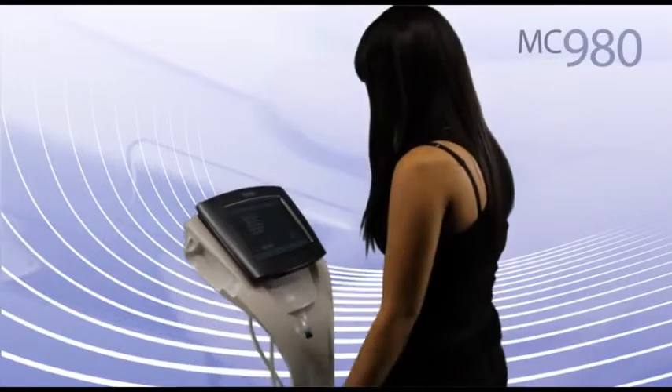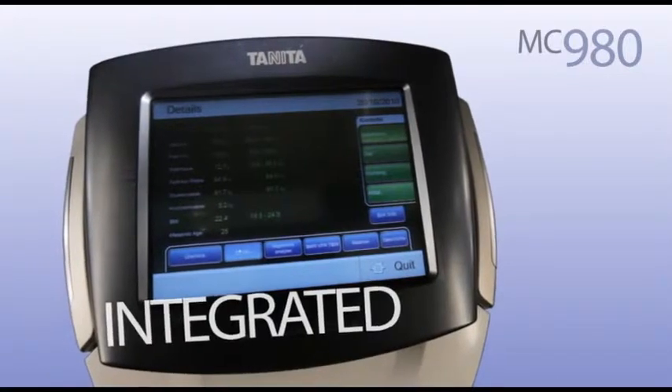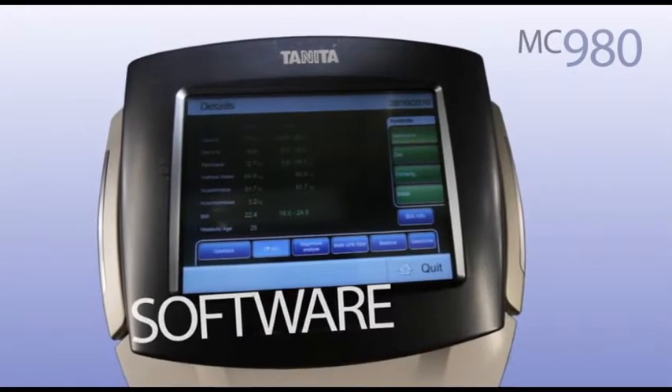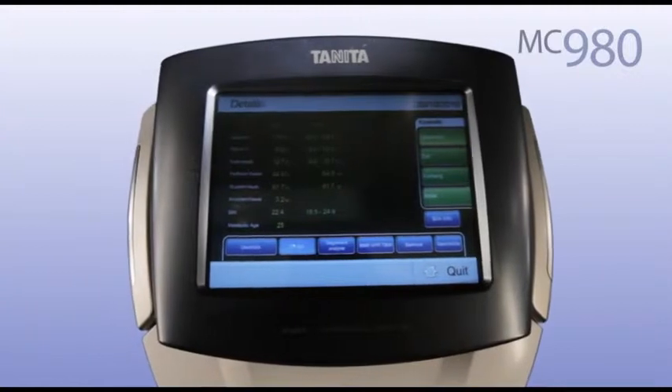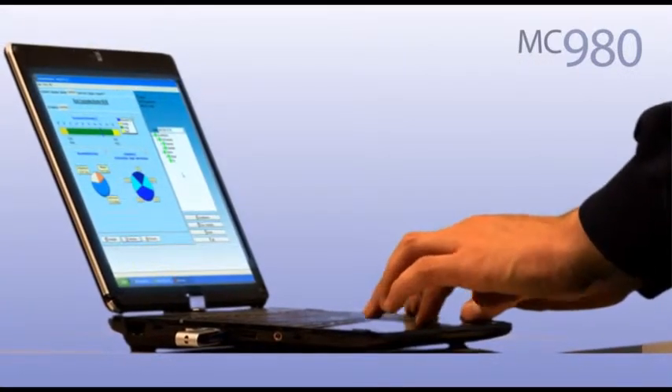In addition to its state-of-the-art measurement functionality, the system has been designed for ease of use via the interactive touch screen panel. The flexible integrated Microsoft Windows software enables an easy download of the stored data via USB for comfortable data management and research analysis.